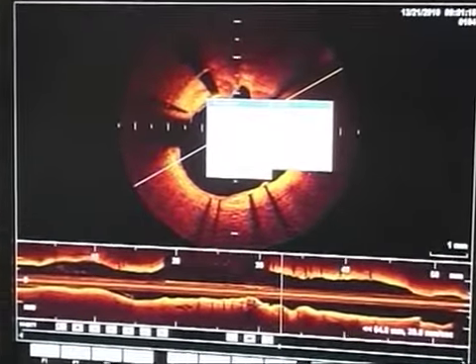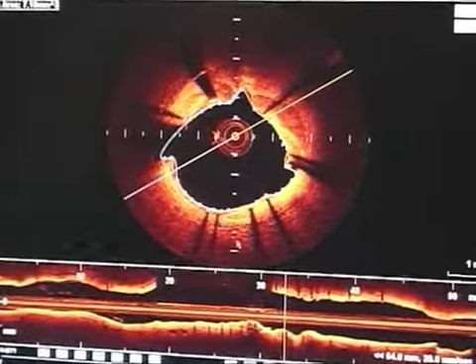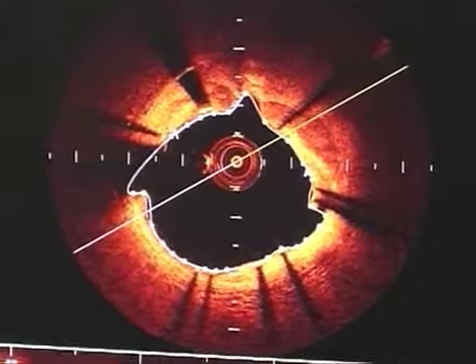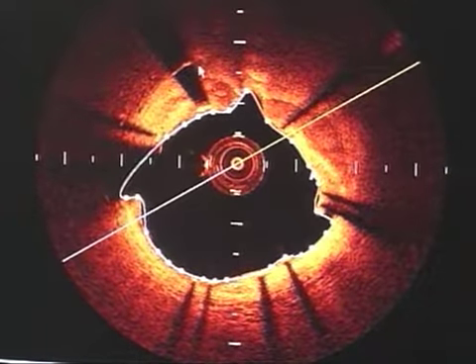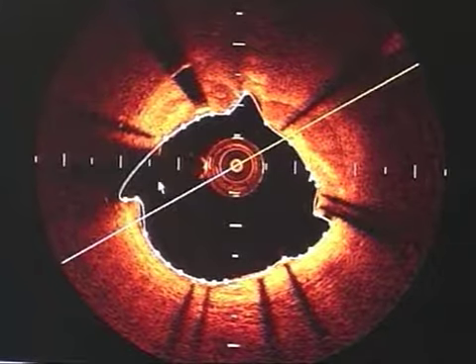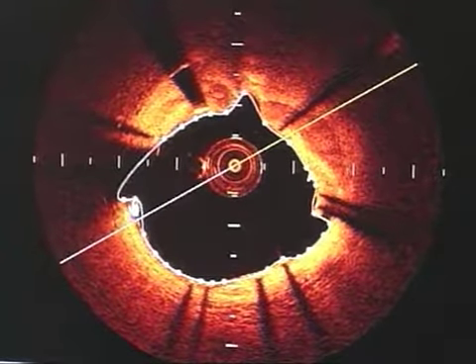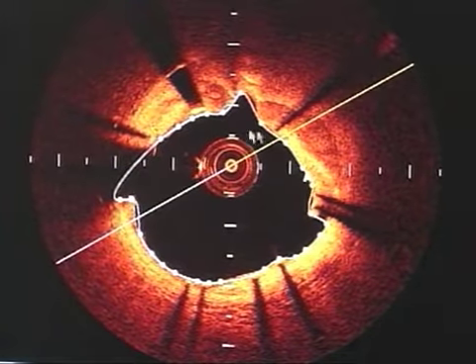So it's very important to analyze the whole stent in the 360 cross-sectional area. Here we're measuring the lumen. You can see it's automatic. There's no risk of underestimating or overestimating the lumen. It's a wide open vessel. Very little neointimal hyperplasia. We can see some. We're going to get the measurements right now.